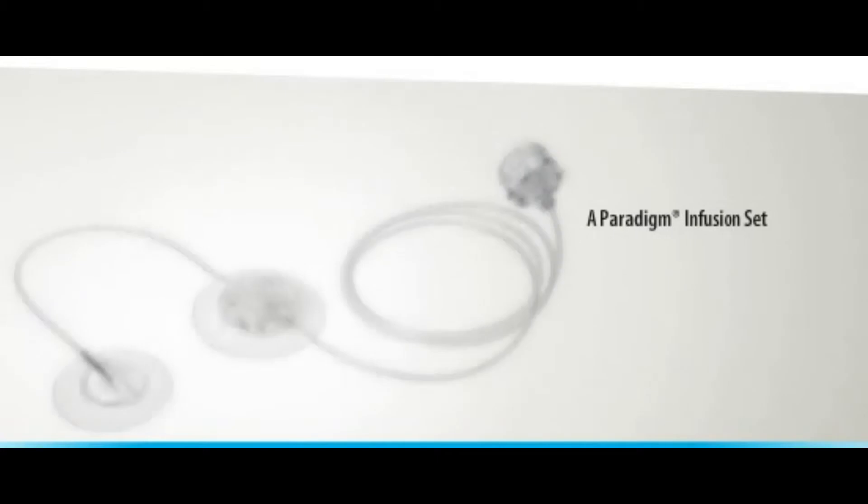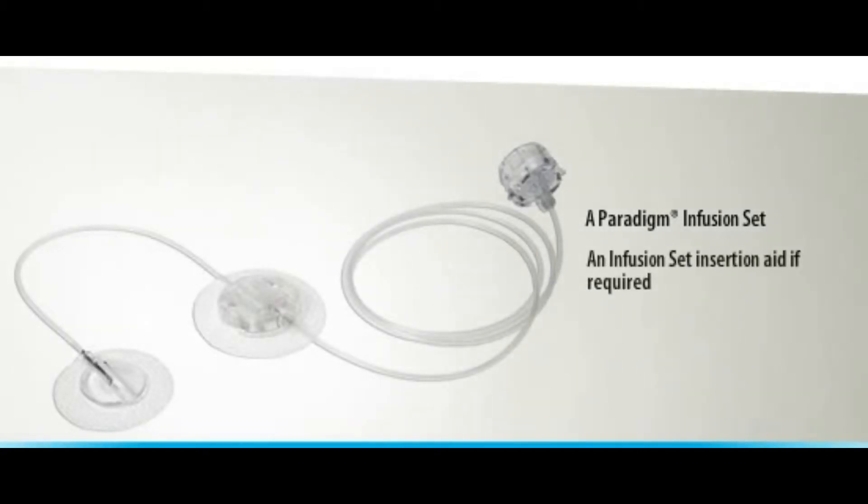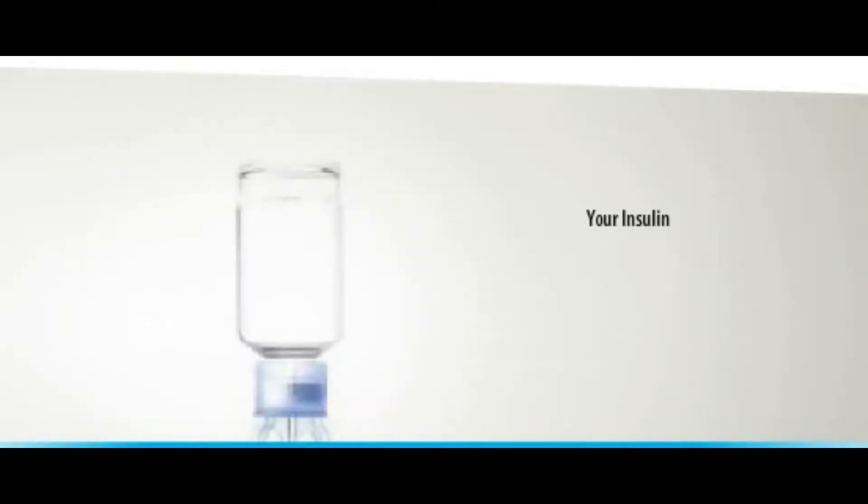In this section you'll need your Paradigm Reservoir, a Paradigm Infusion Set, an Infusion Set Insertion Aid if required, and your insulin.